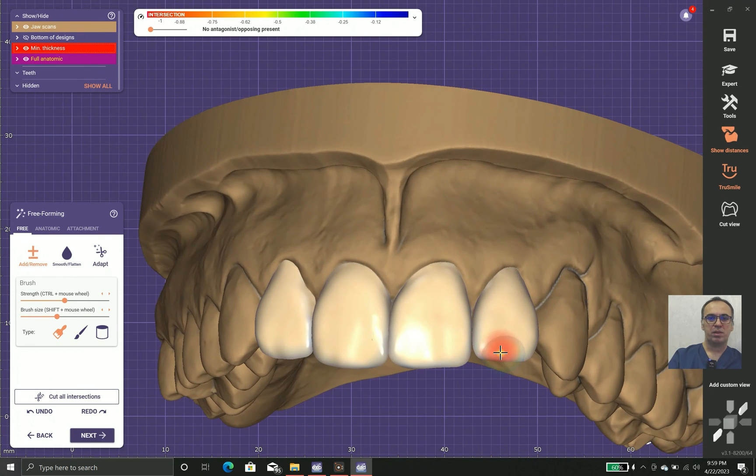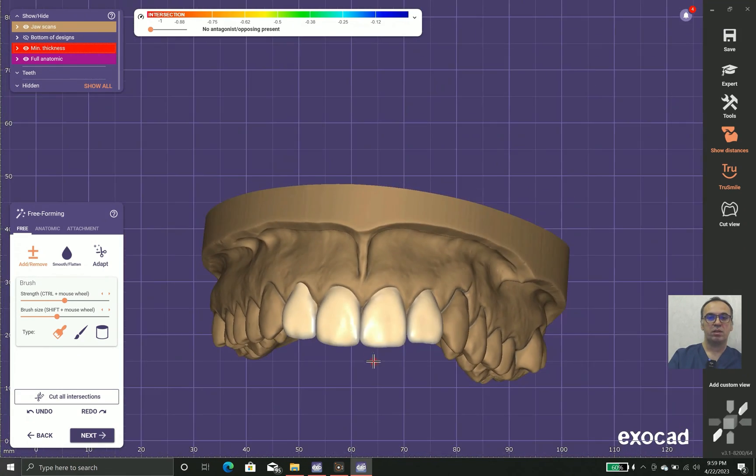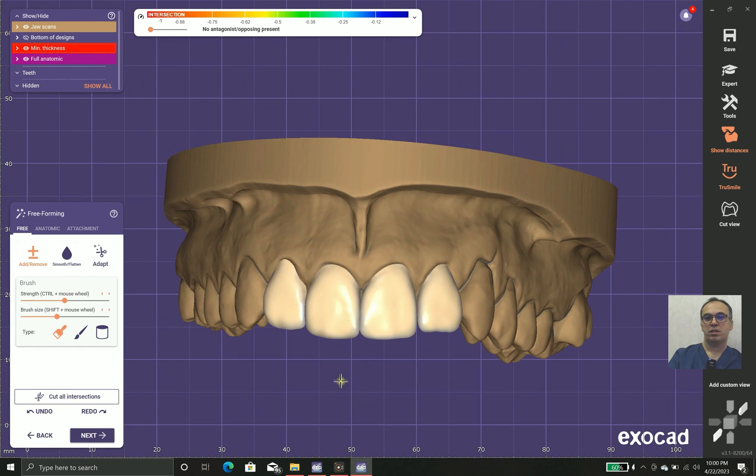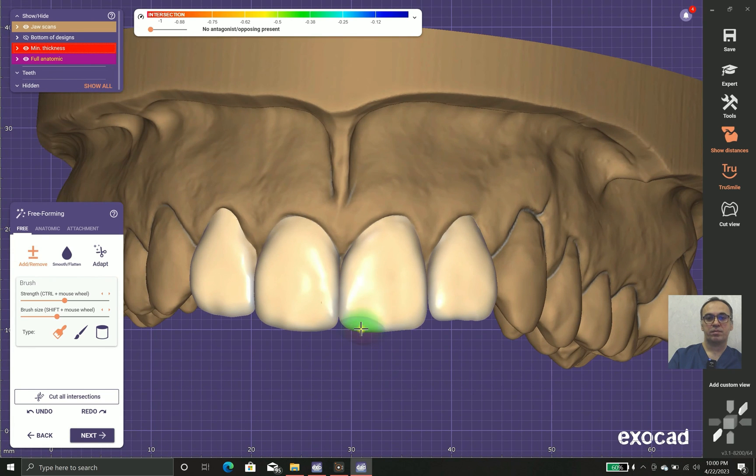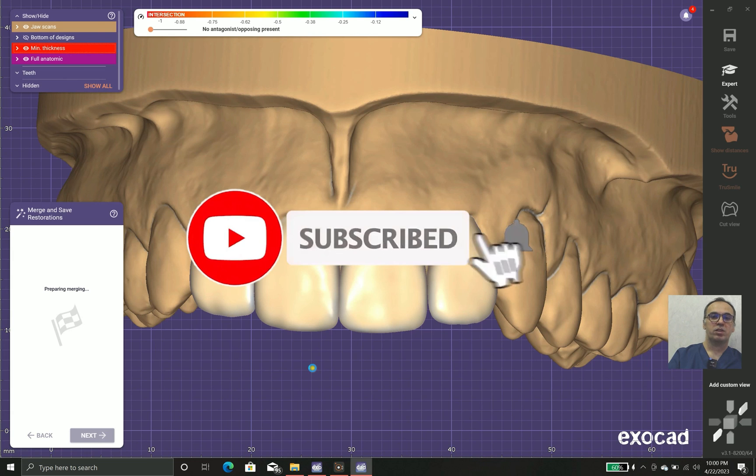We should also communicate with the patient about limitations. As you can see, teeth 1-2 and 2-2 are not identical because the gingival zeniths are different — we are limited by the gingival zenith and cannot change that until the patient returns for crown lengthening or laser surgery and heals. Tooth 2-2 also had a worn incisal edge issue. Since we have a young patient, we preferred the shape of tooth 1-2 and changed the incisal angle accordingly.